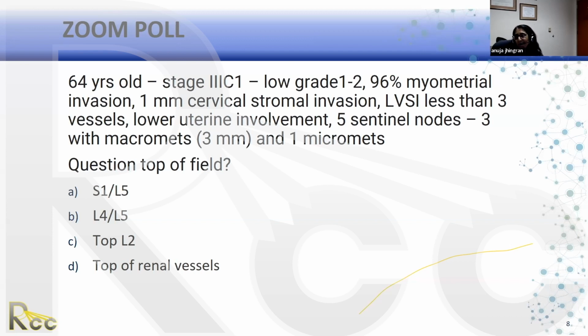And I'll tell you what we kind of decided. Okay, so we have about 74. Yes. All right. As I move to my next slide, I actually don't have an answer, because as I said, there's one wrong answer and there's no right answer. But I'm going to share your results. 56% said L4, L5. 50% of you will treat the pelvis only, which I think is really interesting. The wrong answer is the top of L2.